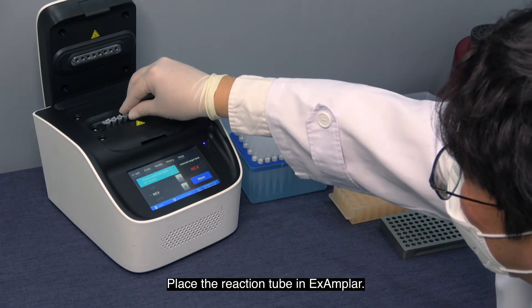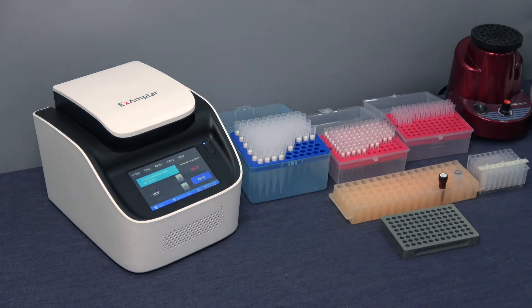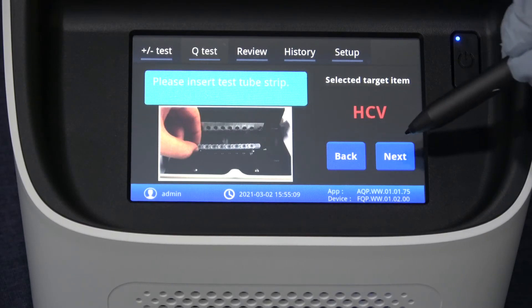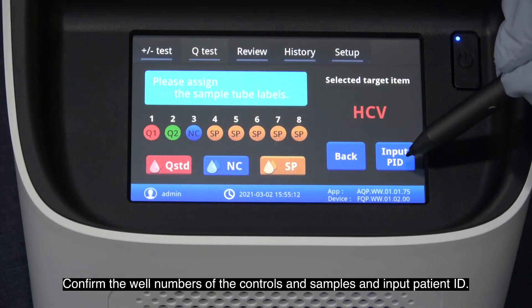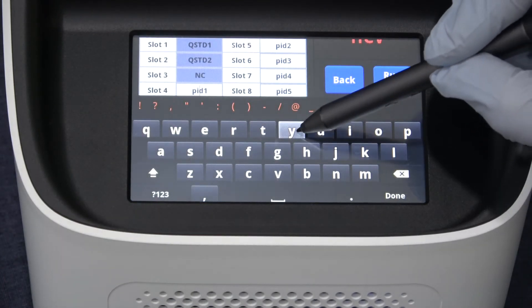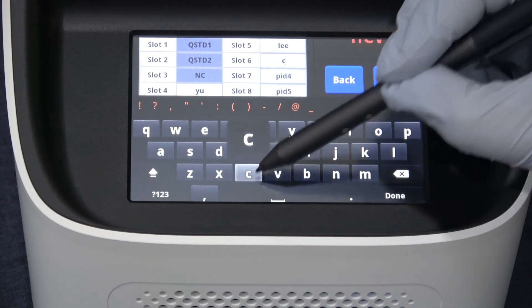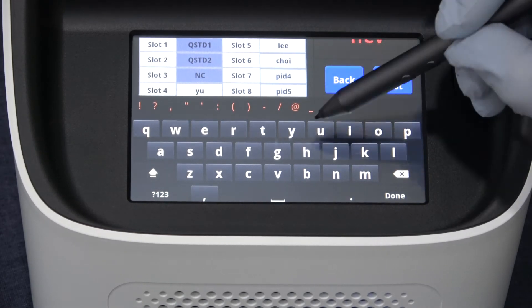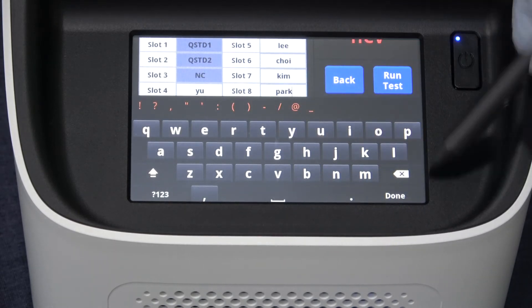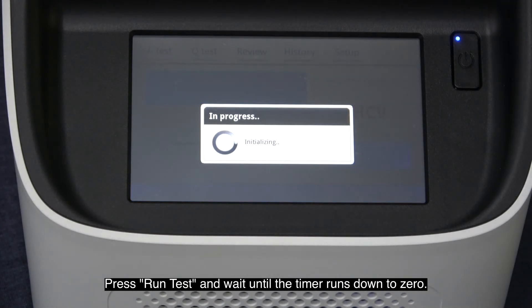Place the reaction tube in the Xampar instrument. Select HCV and press Next. Confirm the well number of controls and samples and input the patient ID. Press Run Test and wait until the timer runs down to zero.